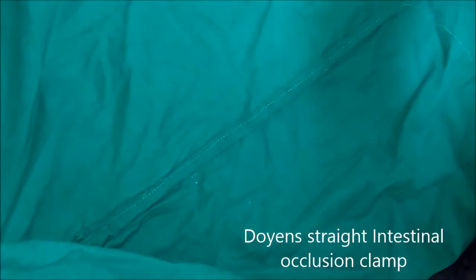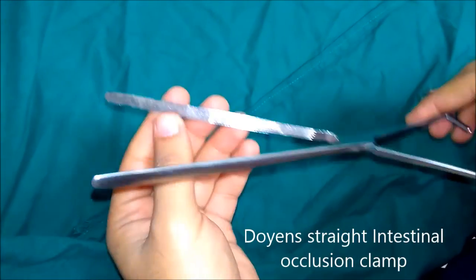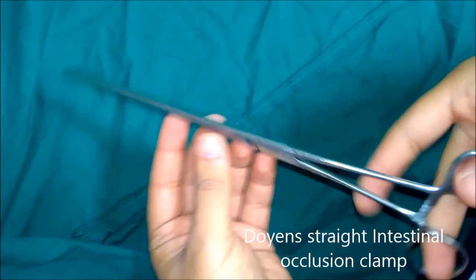This is a straight intestinal occlusion clamp. The blades are lighter and there are vertical serrations in the blade. This instrument is used for gut resection and anastomosis.